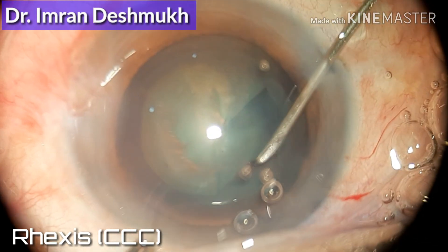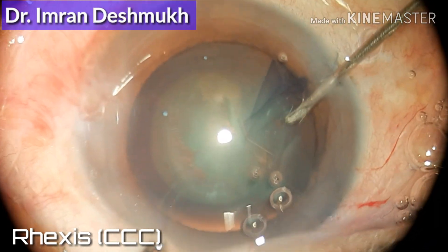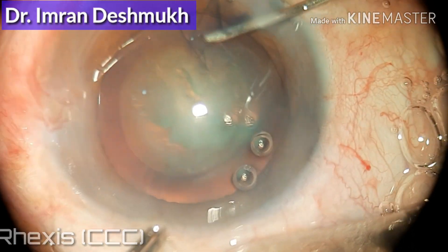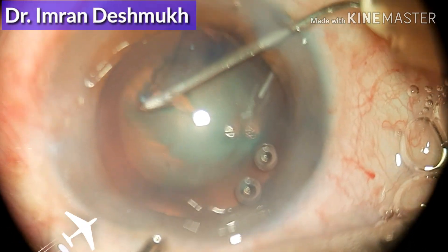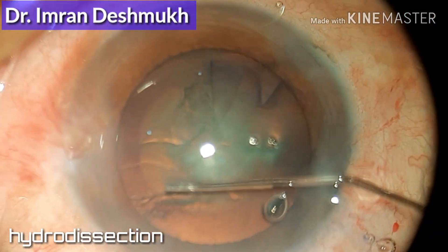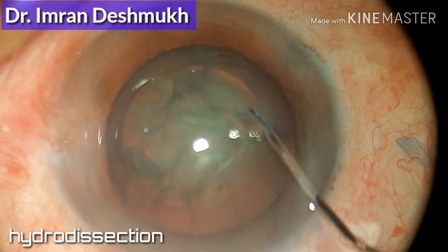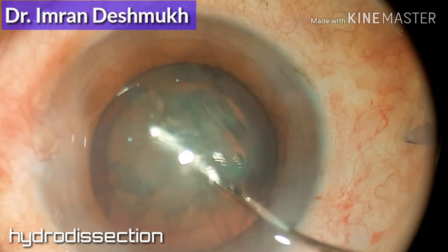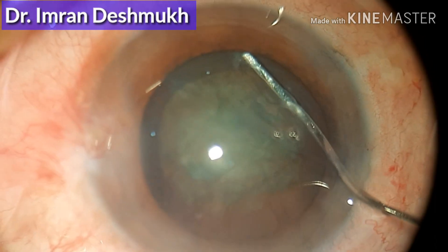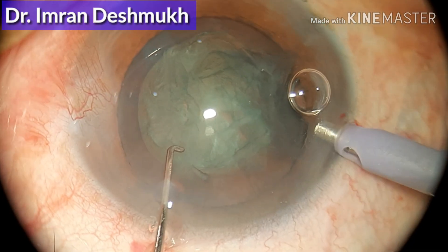One of the important parts for beginners in phacoemulsification cataract surgery is how to divide and conquer the nucleus. It's a bit easier than the stop and chop technique, so I recommend all beginners go with divide and conquer. It's basically dividing the nucleus into at least four quadrants — like four pieces of pizza.